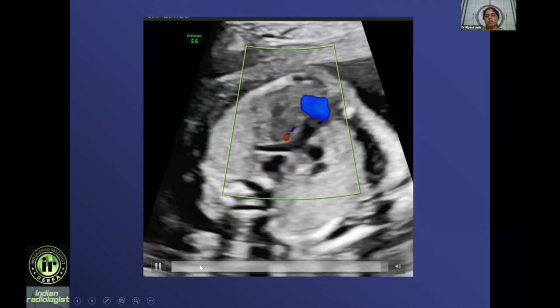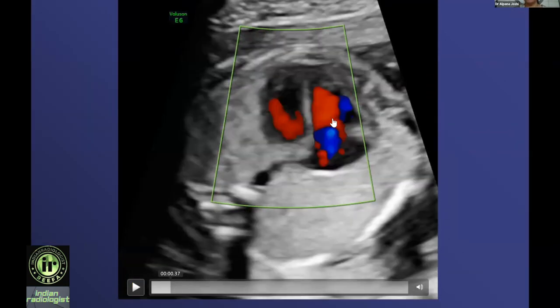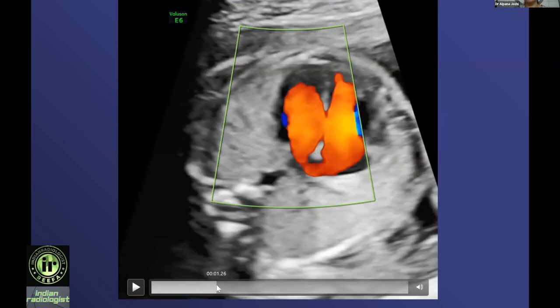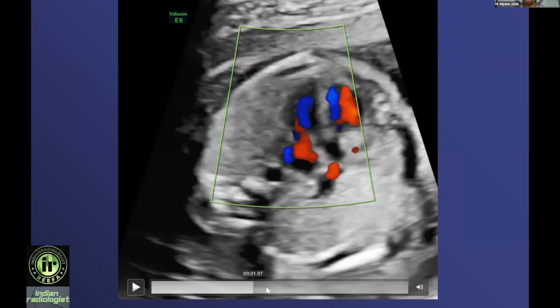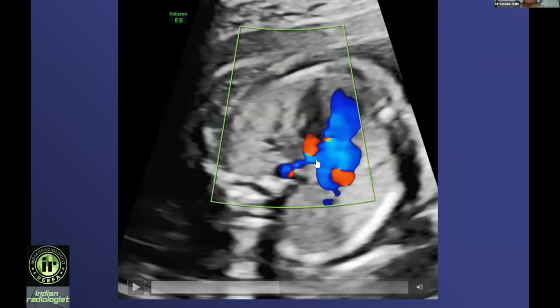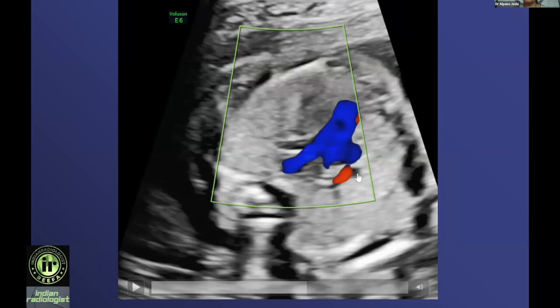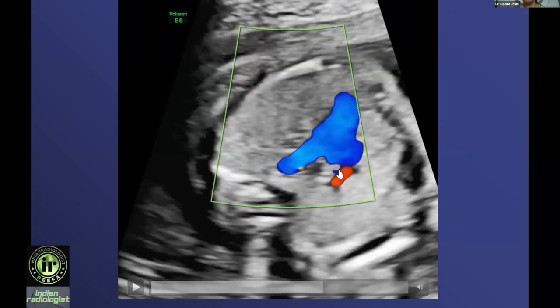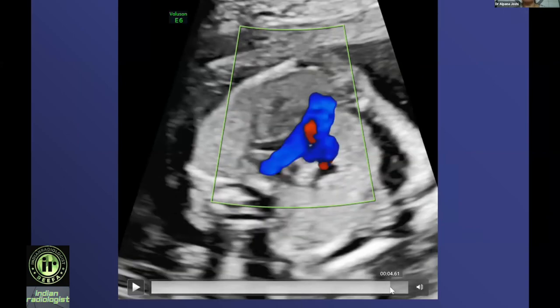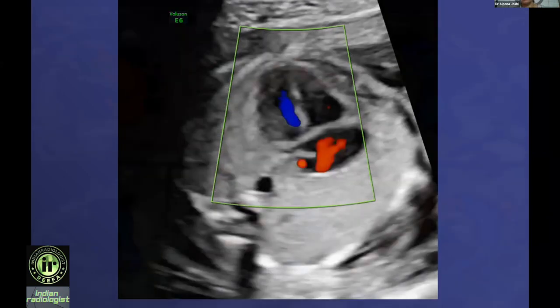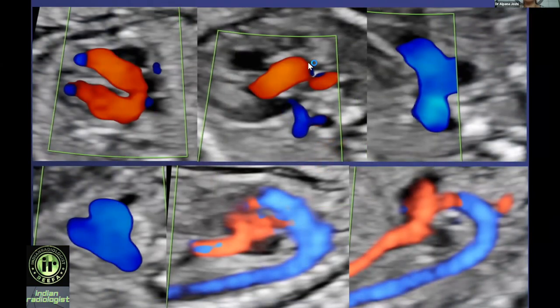These are typically the two inflows and two outflows. In one sweep you can literally see everything. These are the two inflows, then as you come towards the outflow, this is the LVOT in the center of the heart carrying blood away, seen in blue away from the transducer. Then there is the RVOT where the bifurcation is seen, then the three vessel trachea view — the SVC, the aorta and the pulmonary — and you can see the azygos joining the SVC, even in a 2D image. You don't really need anything else to say that this heart is normal.